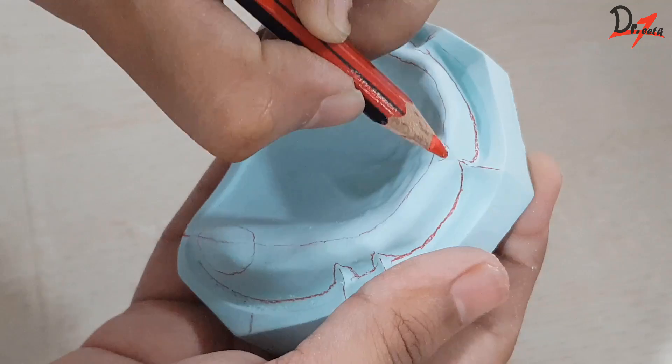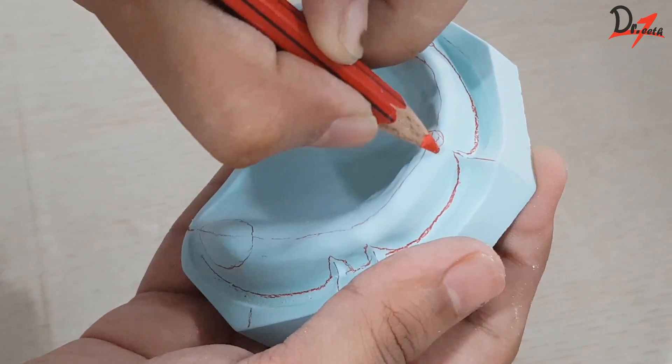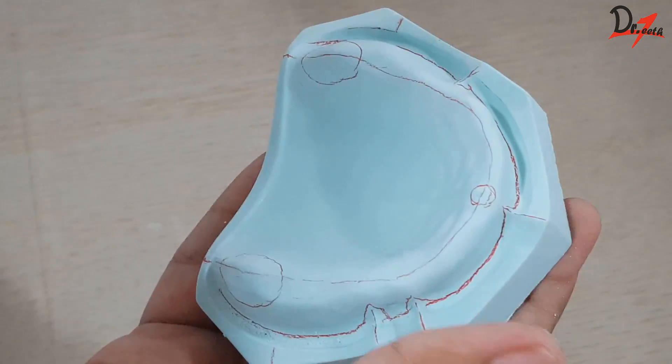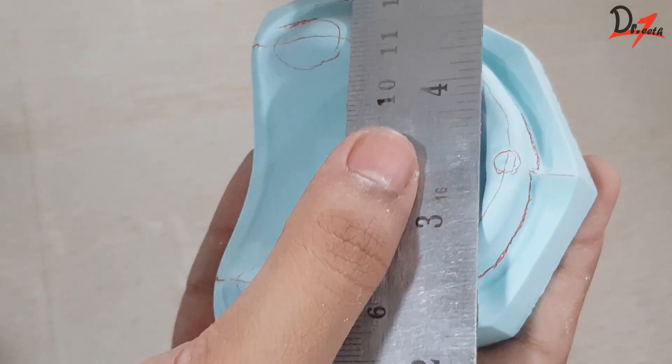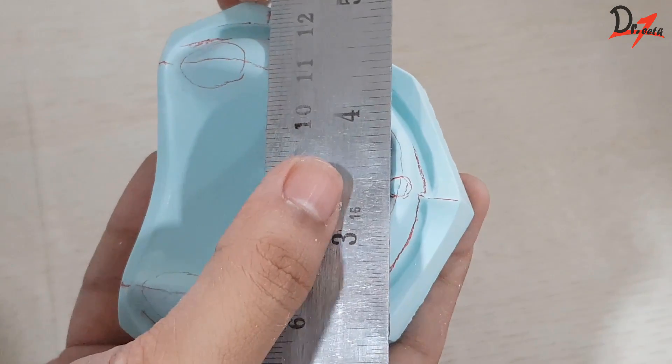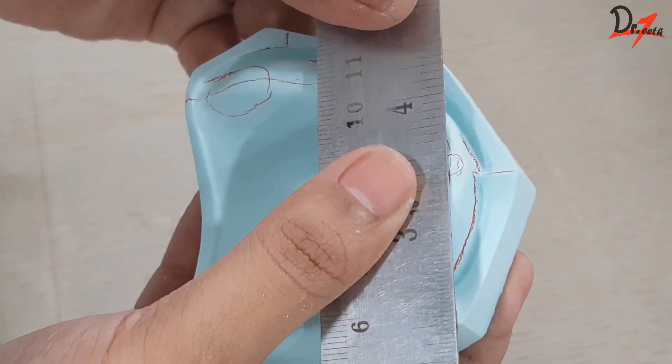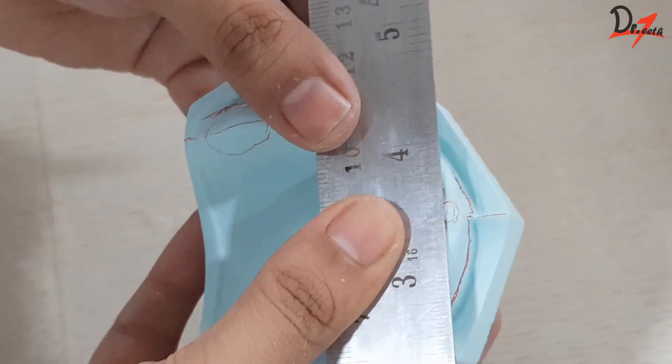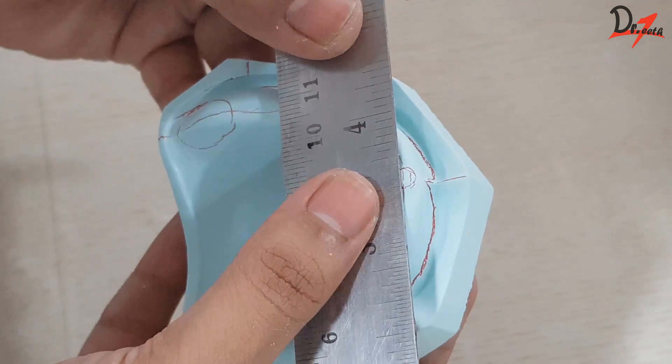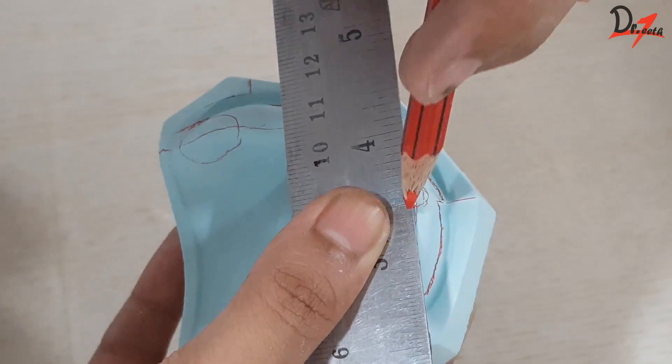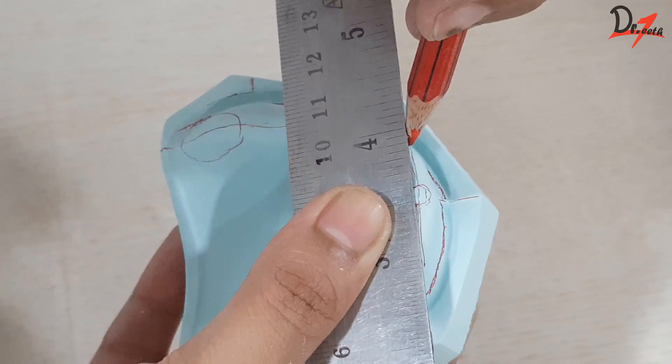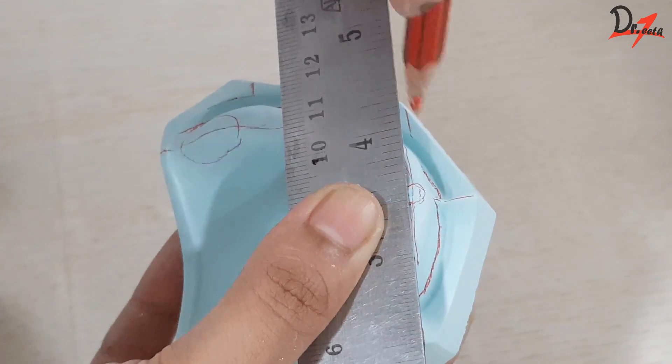Then we will mark the incisive papilla. And we will take a measuring scale and bisect this incisive papilla. Now when you bisect it, we will draw a line on the ridge and will extend it to the land area. When we bisect it from the center, the line will end at the end of the lateral incisor.